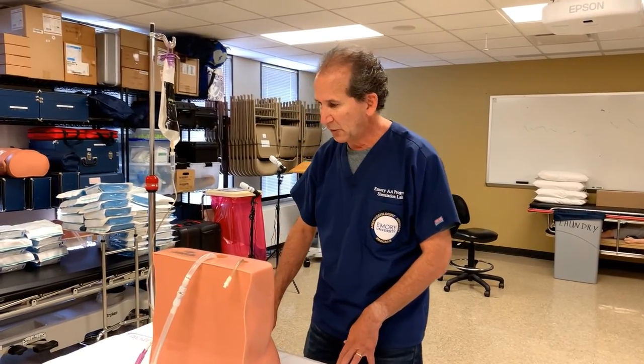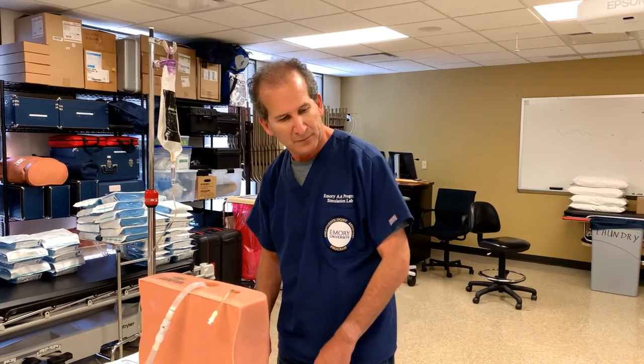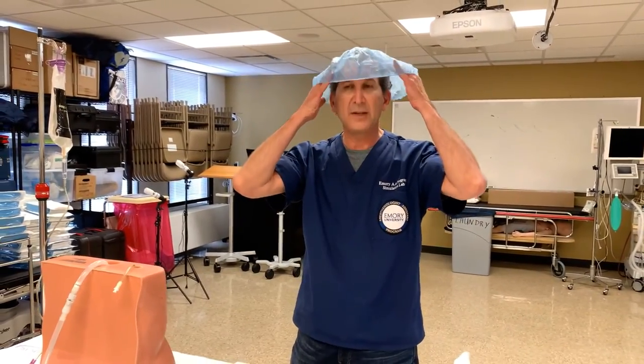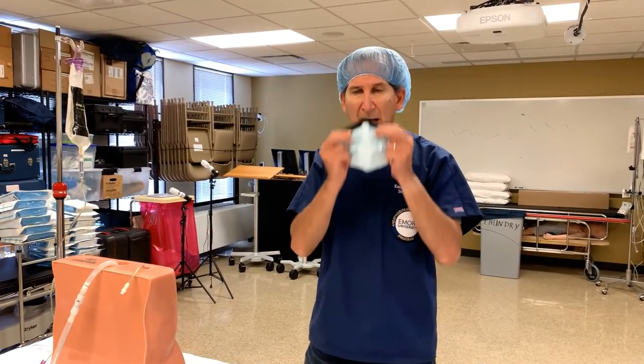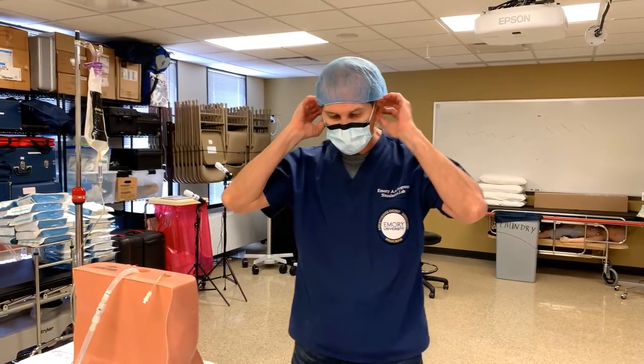We're going to get started and run through the steps. I'll start off by donning my PPE — placing a surgical hat and a surgical mask for this procedure.